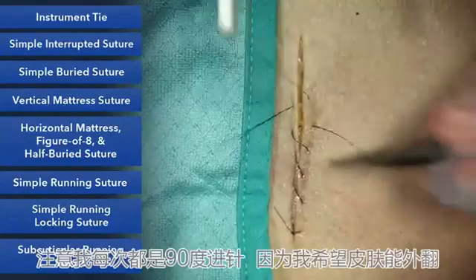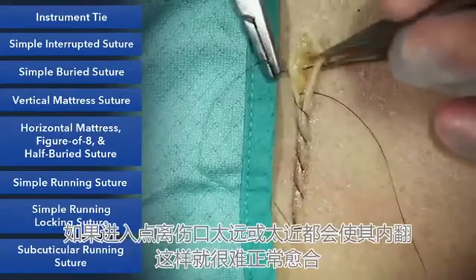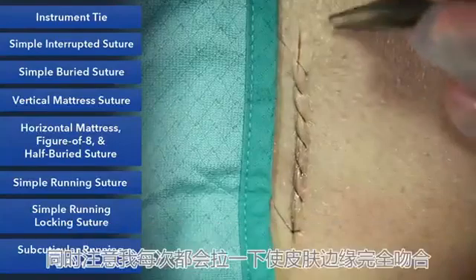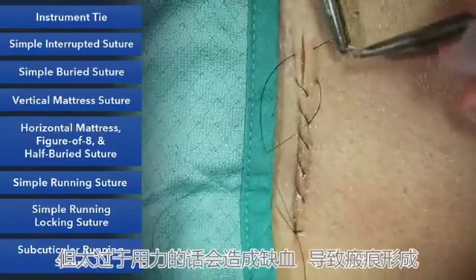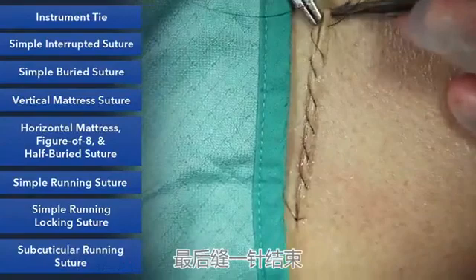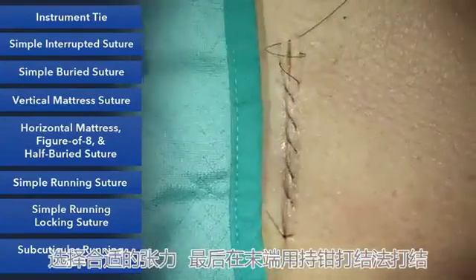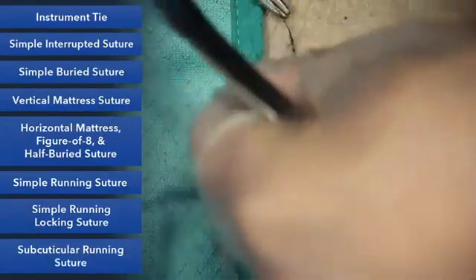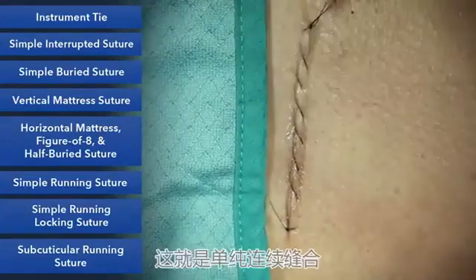Notice I'm exaggerating my 90 degrees because I want this to evert. If I go too far back on the skin or I take too shallow a bite, I will end up inverting the skin and it won't heal correctly. Notice also I'm just pulling up enough on the suture just so that the skin edges touch. Pulling up on the suture very hard is just ischemic and can cause bad scarring. I'll end it with a simple little bite at the end. Make sure we have enough tension along the incision, and then do our instrument tie at the end. And this is a simple running closure.